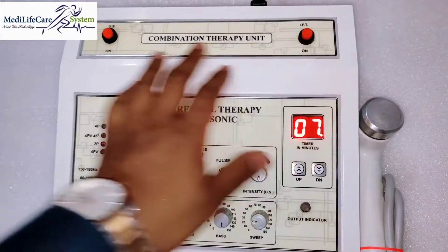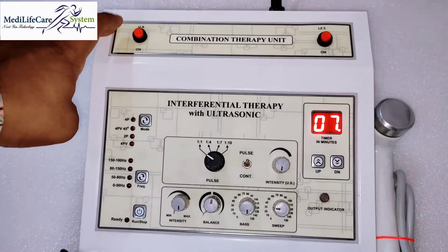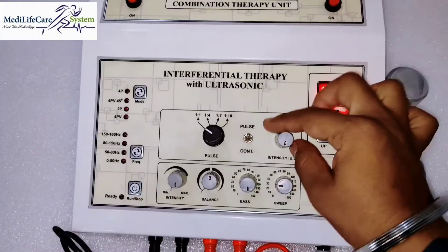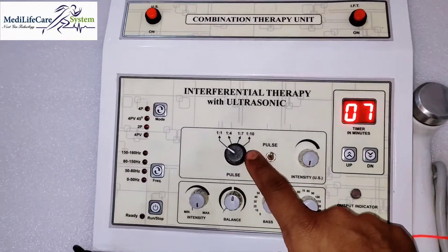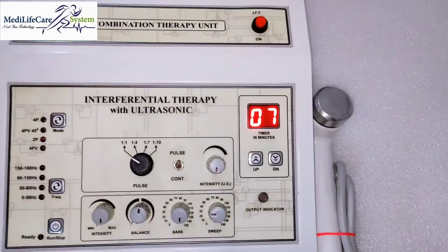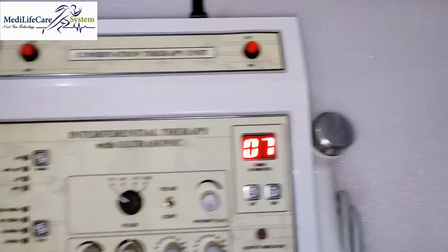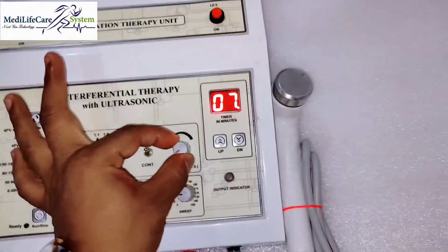If you want to start only ultrasound, simply press this button and the ultrasound will start. This is the intensity knob. This is the mode selector — continuous and pulse. These are the pulse ratios for the output. You can see here the power of the ultrasonic head — simply start from here.